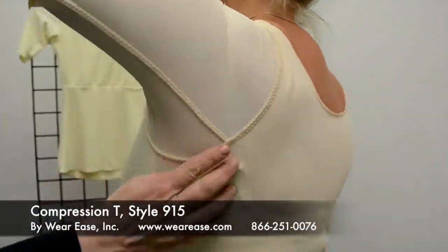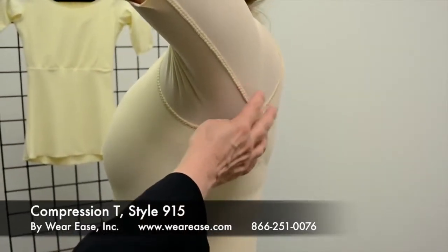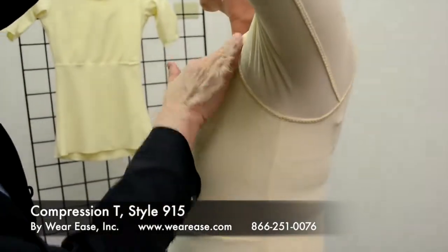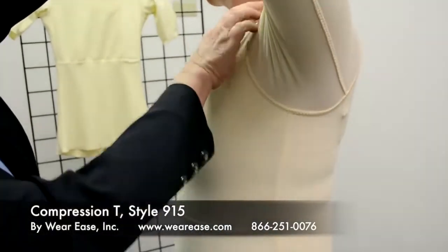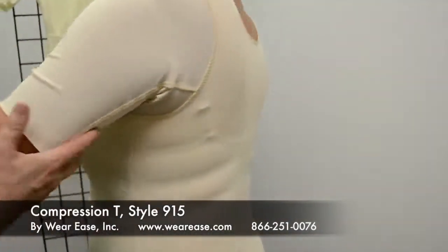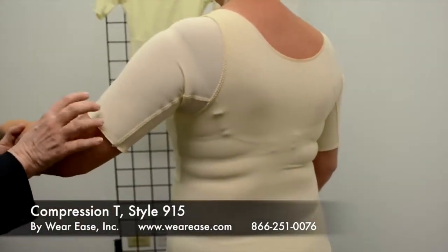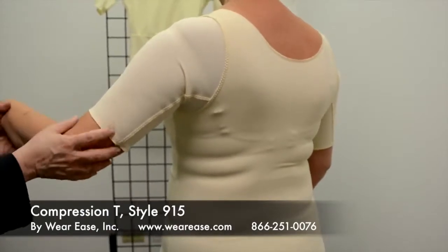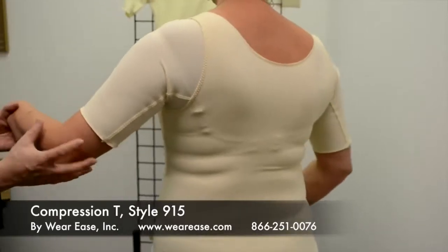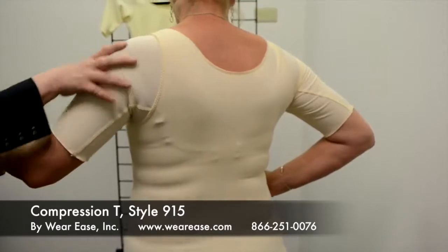As you'll notice the sleeve — we have put the seam on the outside of the garment so there's no seam touching the skin. The main feature is to provide additional coverage for under the arm and the front of the chest, as well as to cover the upper arm, which is frequently left bare when a woman is wearing a compression bra, compression vest, or camisole and a compression sleeve. This area right here would be bare.